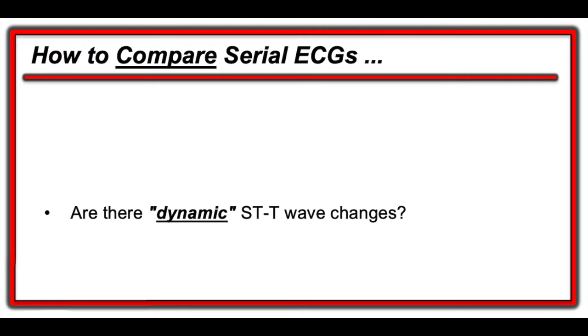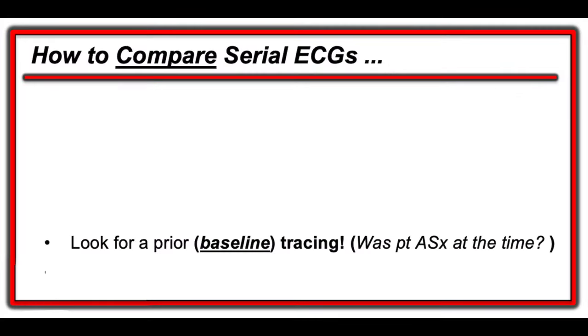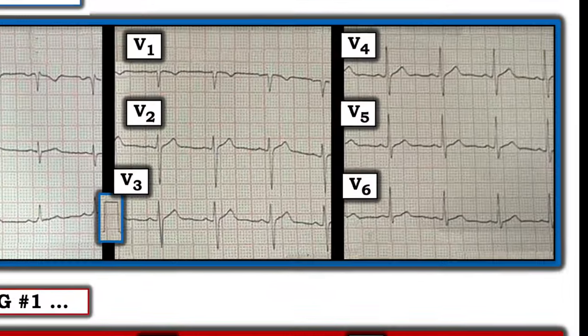Are there dynamic ST segment and T wave changes? I don't know how many of you have heard of that concept. I'm going to go over it in a second. You could look for a baseline tracing. Now, remember, I said to me, this is ST segment straightening.